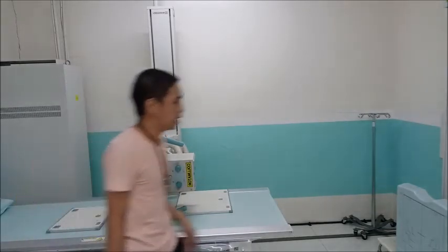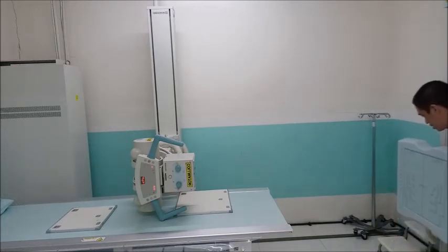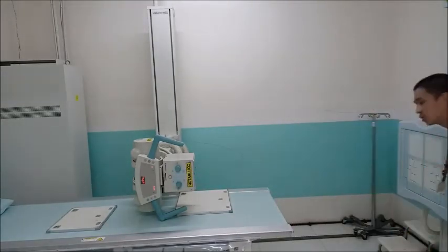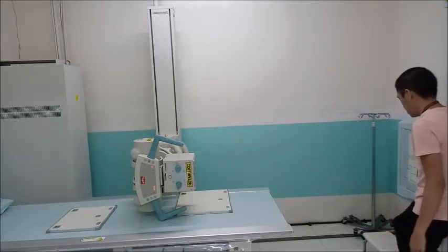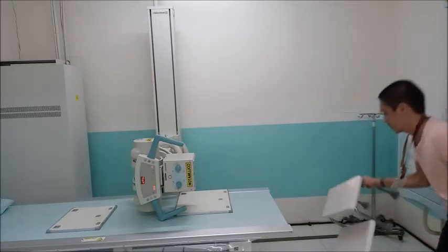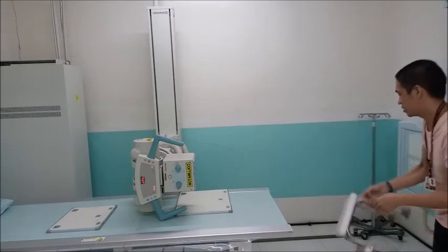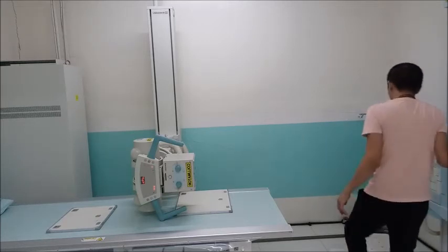So what to do if the patient cannot reach? This is the chest stand. This is the lowest portion of the X-ray tube. It also helps with 14 by 14. So you can ask the patient to step on the stepping stool. That's why we have the stepping stool in these departments.